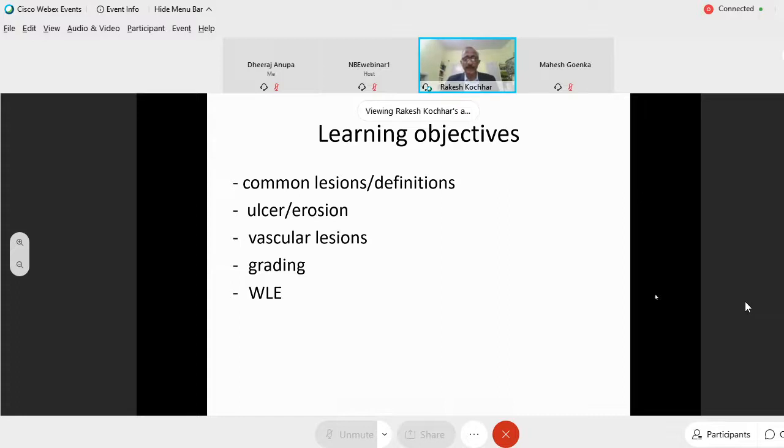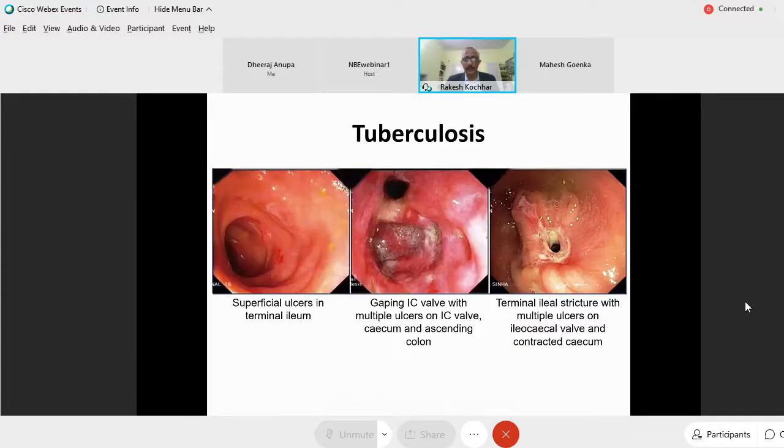Curriculum. And why I have restricted to white light endoscopy is because that is the conventional way we continue to do endoscopy. And in India, while narrowband imaging is widely available now, still the majority of the people, rather all the people, even at institutes like PGI, continue to use white light endoscopy for most of the procedures. For selected lesions, we switch over to narrowband imaging.